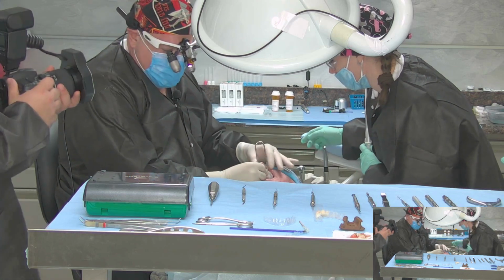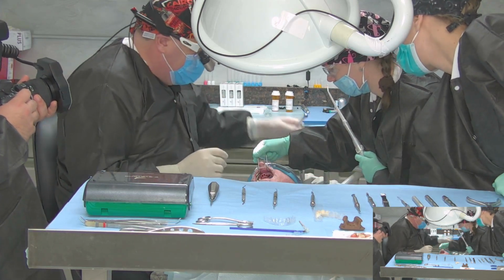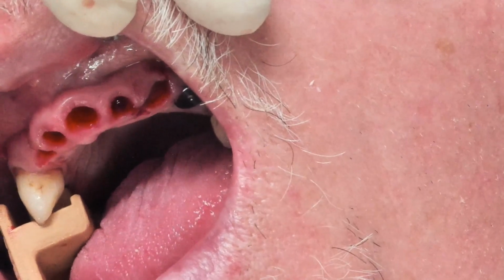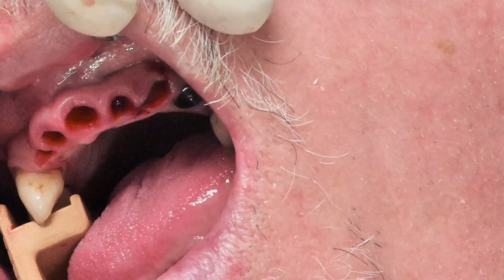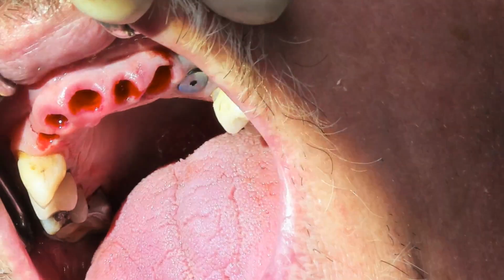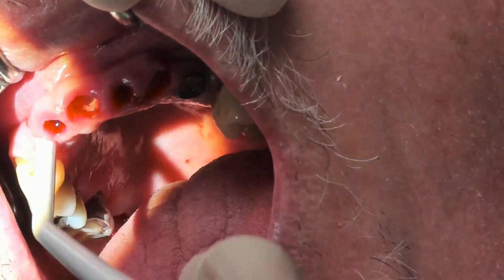So let's get back. I've already got the site marking now of where our implant sites are. I don't know if we'll be able to see this or not, but let's try. Let me have the guide, and do you have the mirror? Before I go in, I'm going to want you to suction. I'm not going to be able to get through the tissue, so let me see the mirror.